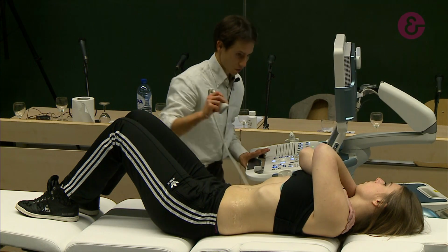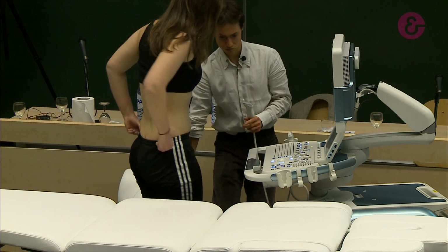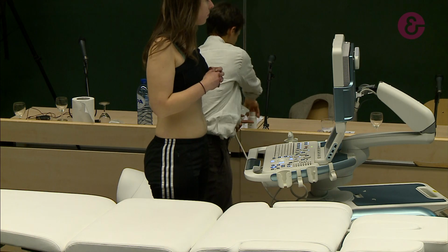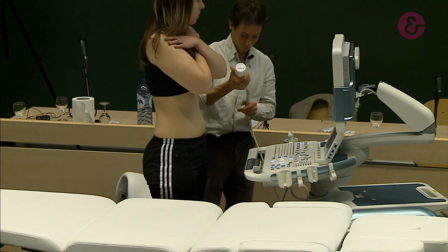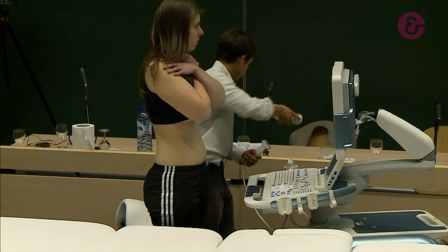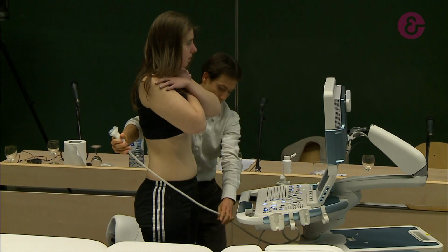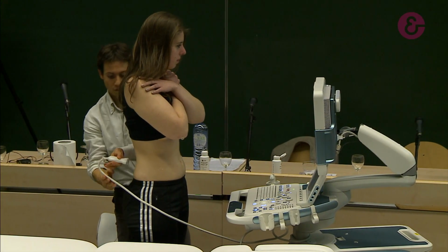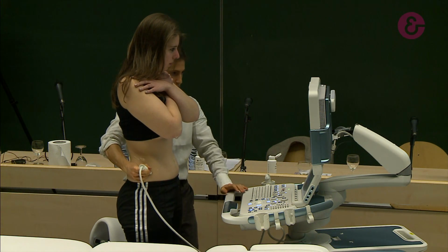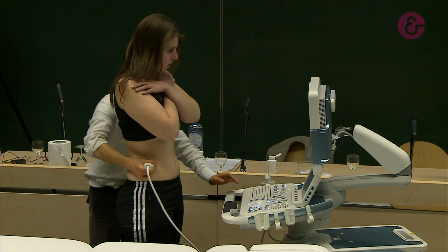And now we can perform another exercise, a more functional exercise. It's a semi-squat exercise. So I need to put some gel. Okay.